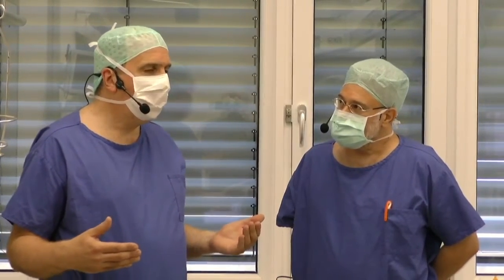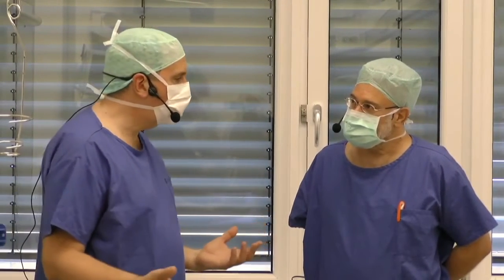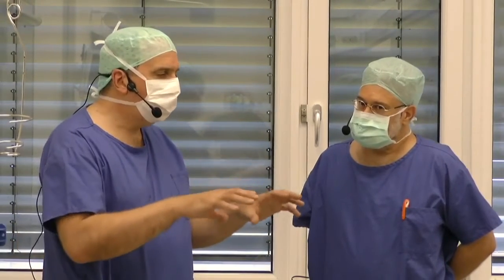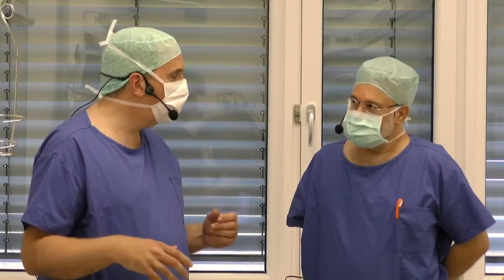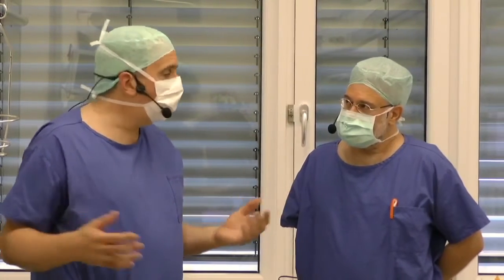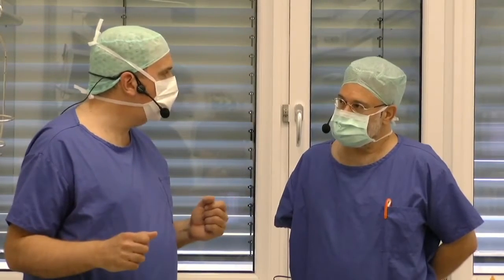The other thing is, if there's any need to adapt this lens, let's say the astigmatic change or whatever, it's much easier to adapt the lens to the new situation in this kind of lens system, where in all other cases, after several months or years, you cannot change anything.